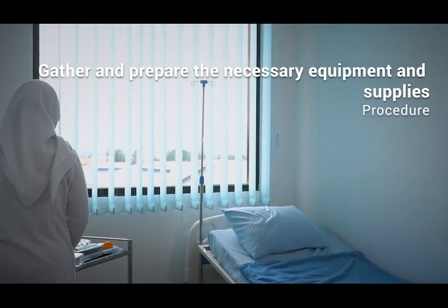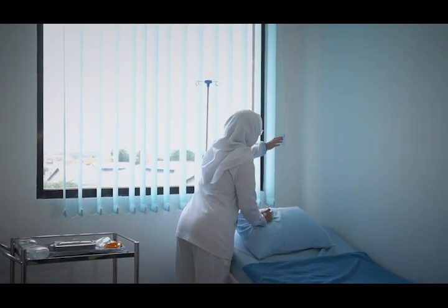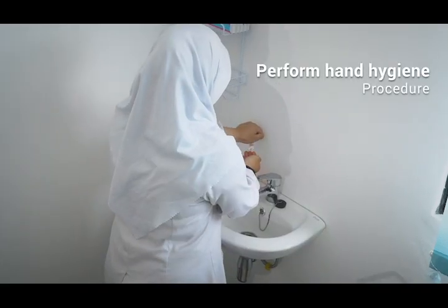Procedure: gather and prepare the necessary equipment and supplies. Perform hand hygiene.